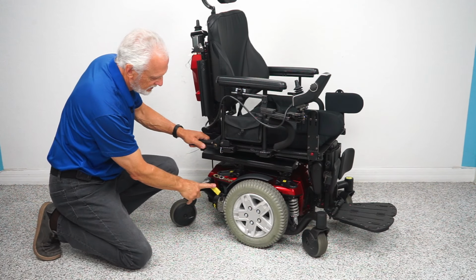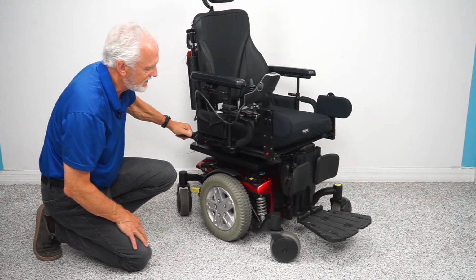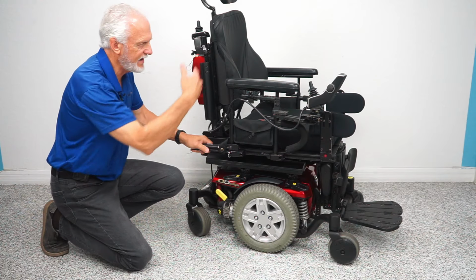Power is off. Take the yellow handle, and look at that, folks. Look how easy that is. There's your other motor, okay? It's that easy. And when you're done, put it back in gear, turn your power on, give it about 4 or 5 seconds to recalibrate.